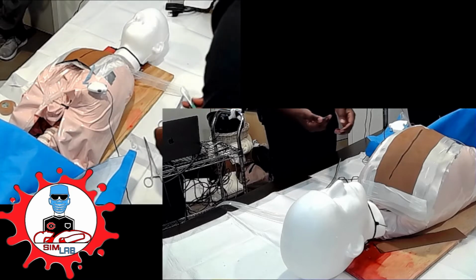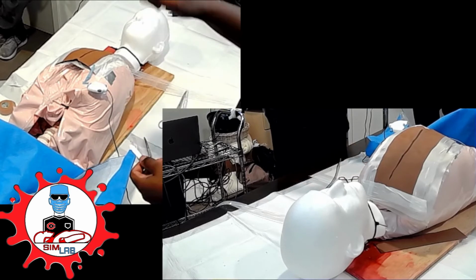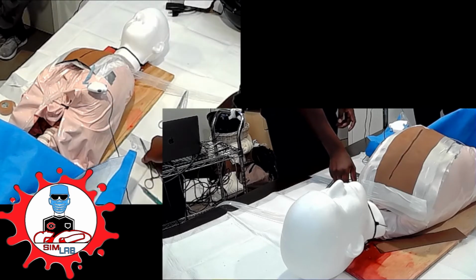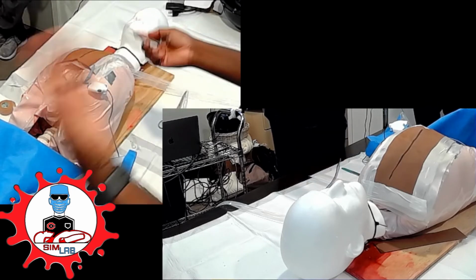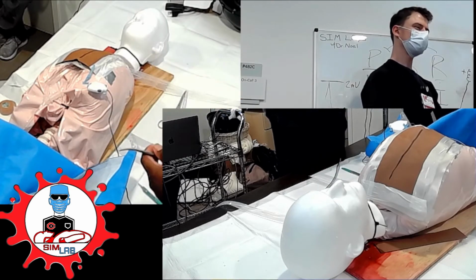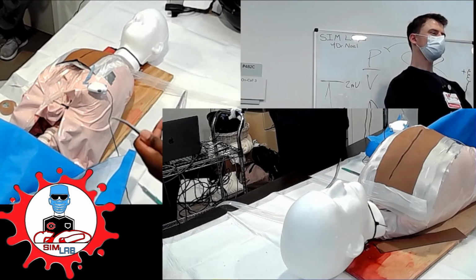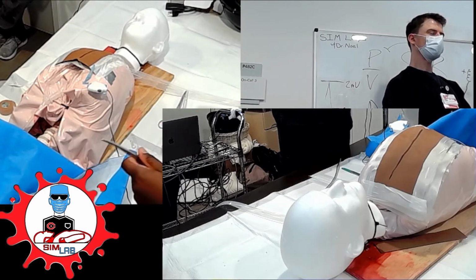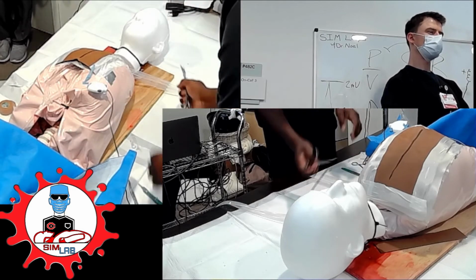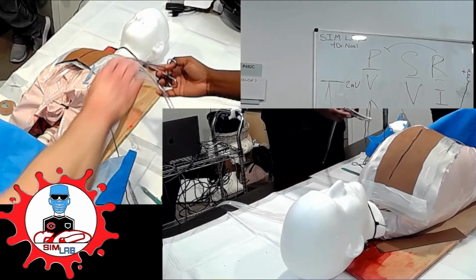So we make an incision about 1 to 2 centimeters, enough to get the finger in. Make the skin incision, then use the blunt Kelly for blunt dissection all the way down on top of the rib and not below the rib above, so that I don't injure any intercostal vessels. Once I get into the pleural space, I feel the lung and make sure it's not attached to the chest wall, going around. Then I attach the tube to the Kelly and get it in there.